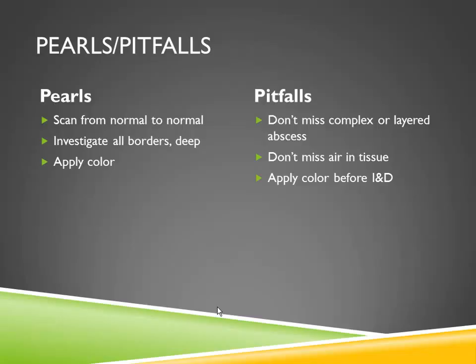And things to look out for, pitfalls: don't miss a complex or a layered abscess just because it's not a perfect, simple fluid collection. I've done it in the past and learned from my mistakes, so hopefully you can see these examples and not make the same mistakes I've made. Don't miss air inside the tissue, which might signal a more serious infection that needs operative treatment in the OR. And again, I said it before, I'll say it again: apply color before you stick a knife in anything.